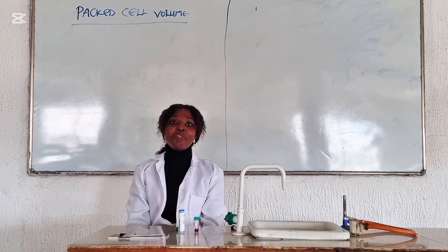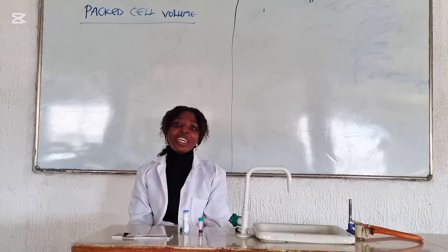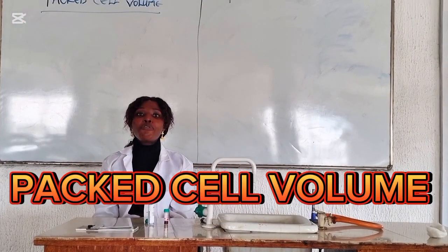Today's class. For today's learning purpose, we'll be talking about packed cell volume.